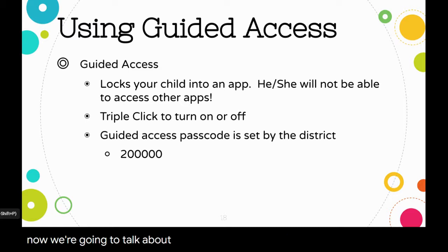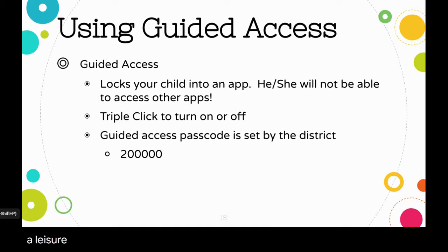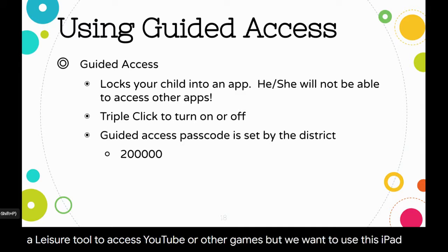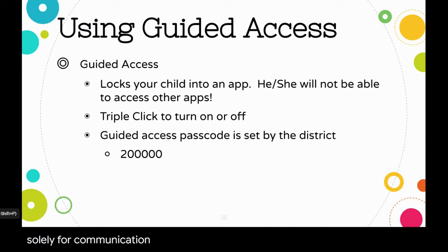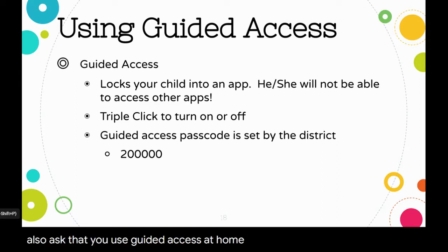Now we're going to talk about guided access. We use guided access to lock your child into the communication app. Many children have had exposure to an iPad as a leisure tool to access YouTube or other games, but we want to use this iPad solely for communication. If they use this iPad to play games or watch videos, then they don't have access to their voice to talk about those experiences. We also ask that you use guided access at home as well and not allow your child to use this iPad for any leisure activities.